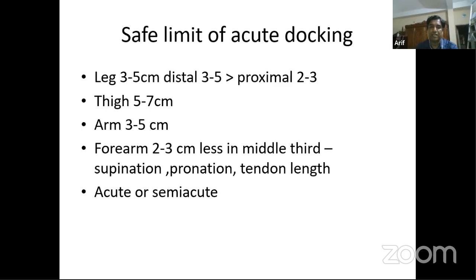Sometimes when you distract bones, the transported bone goes to its counterpart a little bit later, and in the meantime the docking site is filled with fibrous tissue and other things, so the docking union is delayed, and you have to keep the external fixator for a long time. So you should keep this in mind to decrease the external fixator time and increase your patient compliance.